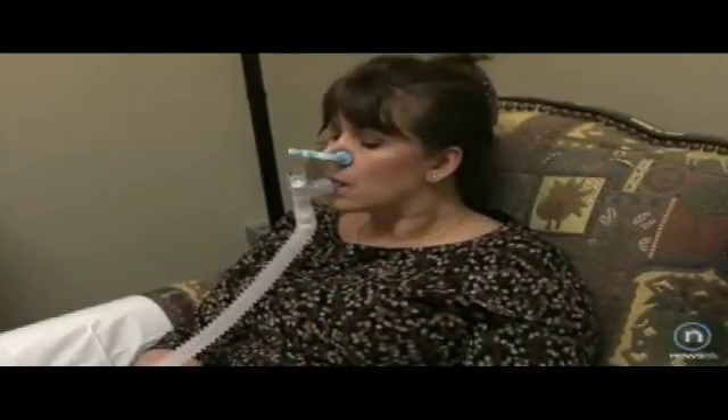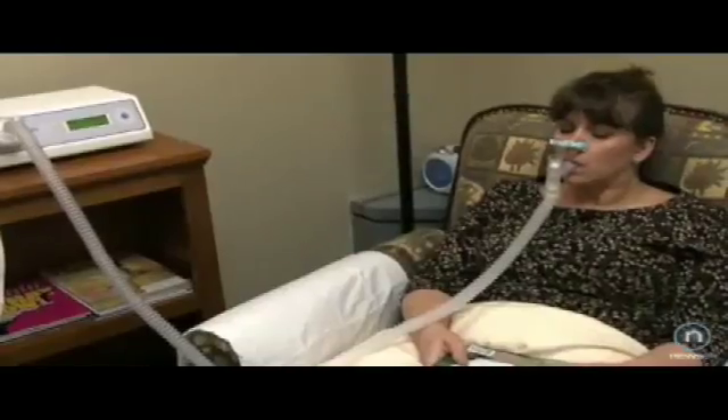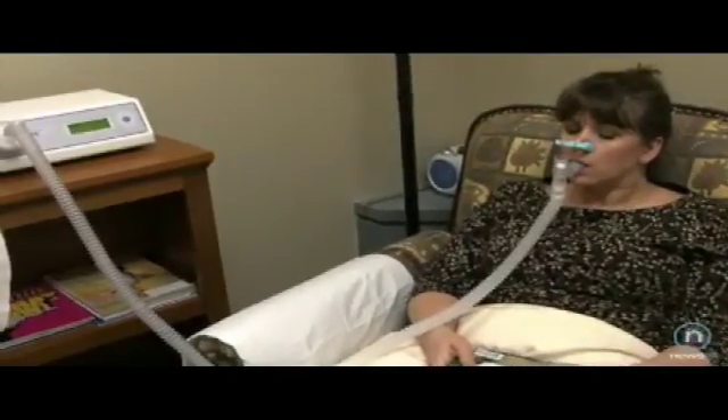We have people come in and sit down and just breathe comfortably into a machine, and then after about 15 minutes we have a result. We sit down, talk to them about it, and say, 'Angie, this is your resting energy expenditure, and this is what you need to do to try to lose some weight.'